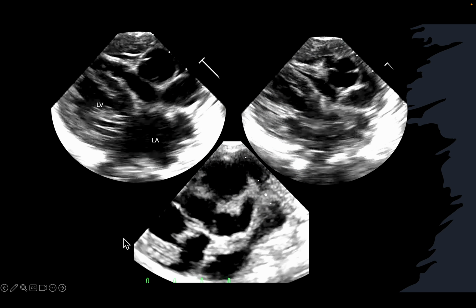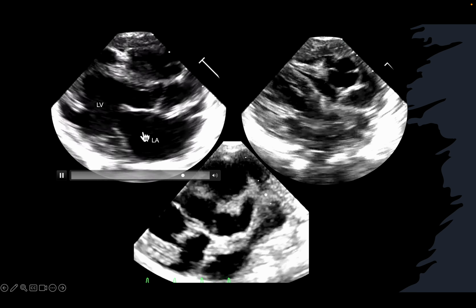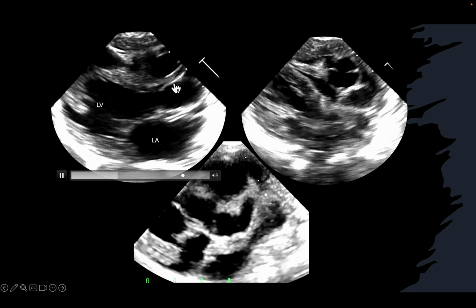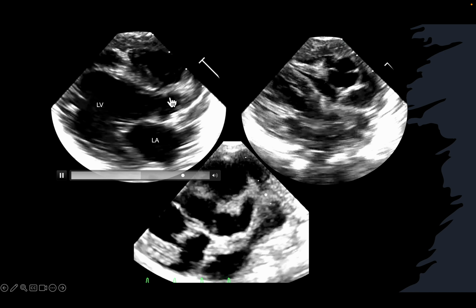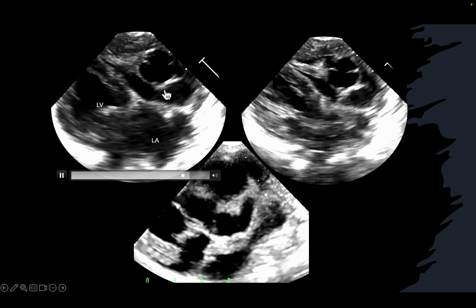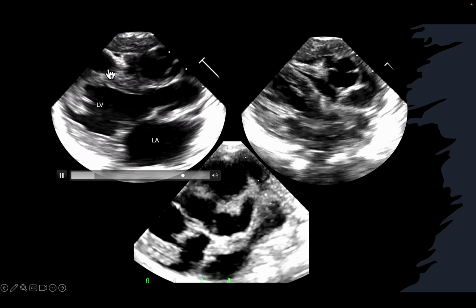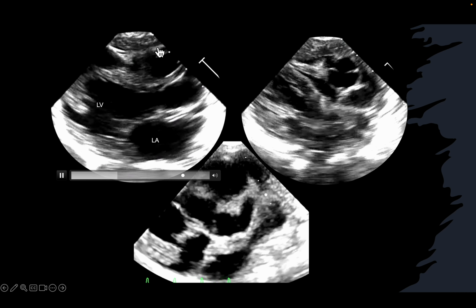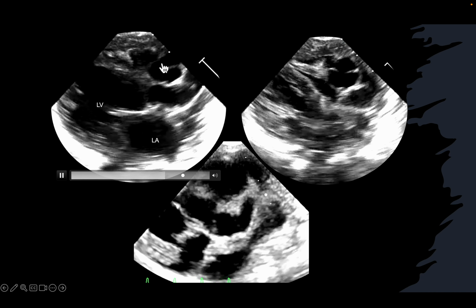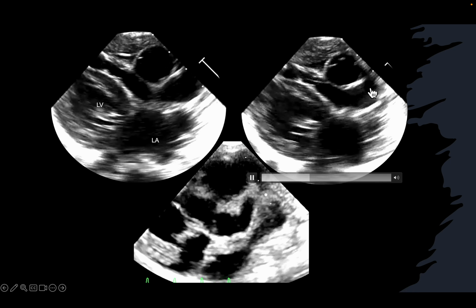So now our search went on, and we saw this is angulation of the left parasternal long axis view. On angulating, you see this artery, the left anterior descending, which is coming out of the aorta, is markedly dilated going through the interventricular septum, right? Incidentally, you see the cross section of the pulmonary artery valve, and you see the pulmonary valve has a thin leaflet. Just a pure coincidental visualization I thought I would share with you.